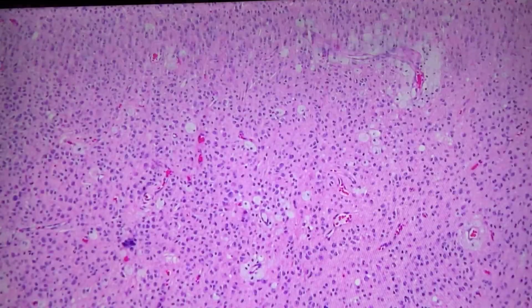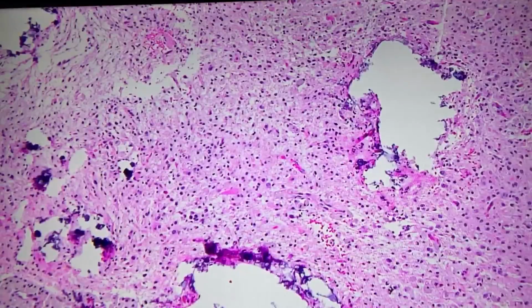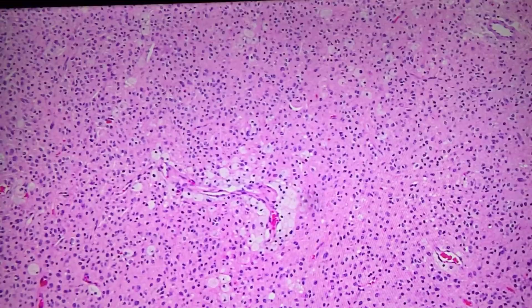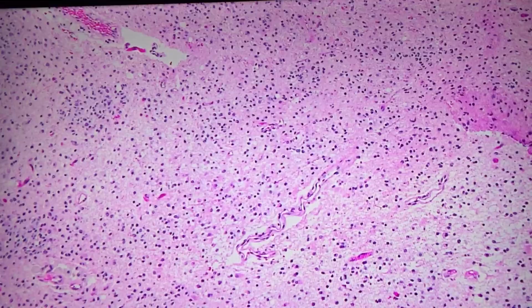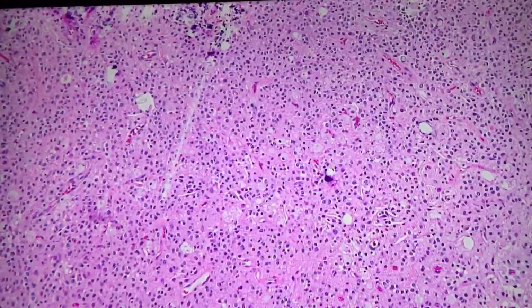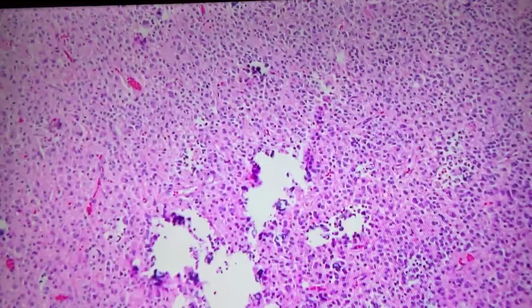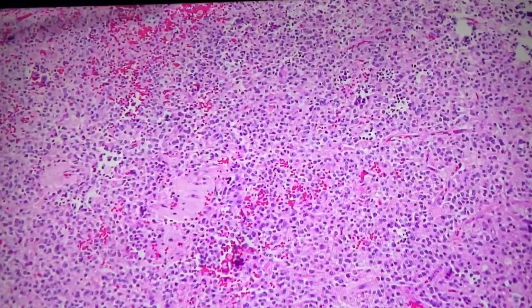My sense from the oligodendroglioma thing is that from the time that we trained to now, everything has changed. This used to be a thing that neuropathologists love to argue about, whether something is oligo or oligoastro or pure astro. And now the molecular stuff has changed it, right? So how do we approach that? What markers do we do? What's considered definitional? Oligodendrogliomas should be IDH1 mutated. So if you get a tumor that you suspect could be an oligo and the IDH1 immunostain is negative, you should rethink your differential diagnosis.